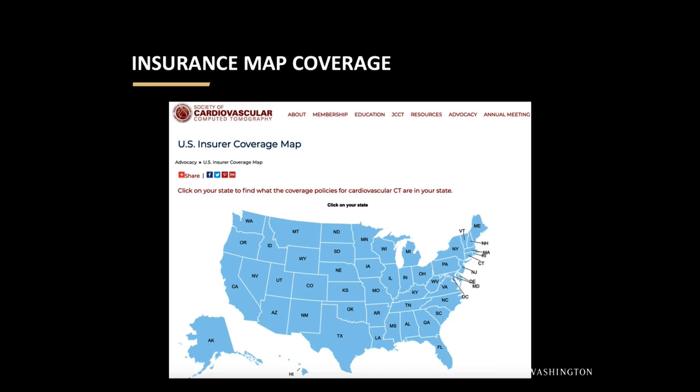I think that's where CTA struggles a little bit. And we know that anatomy and physiology don't always correlate. So if you have a 50% stenosis on CTA, you may ask yourself, is it hemodynamically significant and is it causing the patient's symptoms? You can't tell that just by looking at the CTA. If they have non-obstructive disease or it's normal, that's great. If they have a high-grade stenosis, that's great. But if they fall in between, then you're left with the question, okay, I see it, but is it functionally significant? They may still need a secondary test, like a functional test, or maybe eventually going to the cath lab and getting invasive FFR.